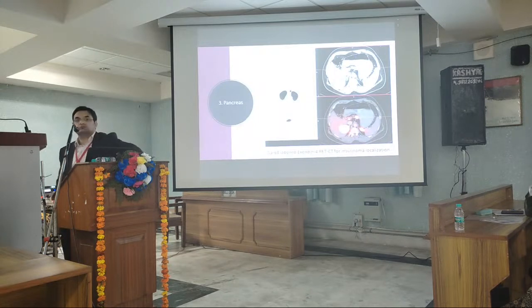No, I think what the questioner wants to say is that instead of venous sampling and all these very tedious procedures, which could not be done or we were not able to succeed with, that's the only way out for this. That's the point we want to make. That's fine, but before that, if you are doing imaging and you get the idea, that will be even better. That's a nuclear medicine point of view. Ultimately, we have to open and see where the lesion is.